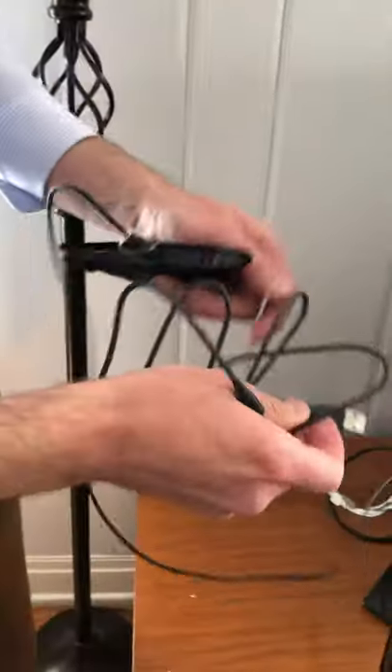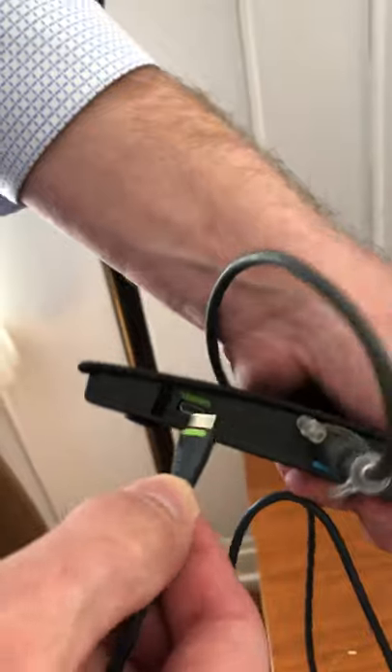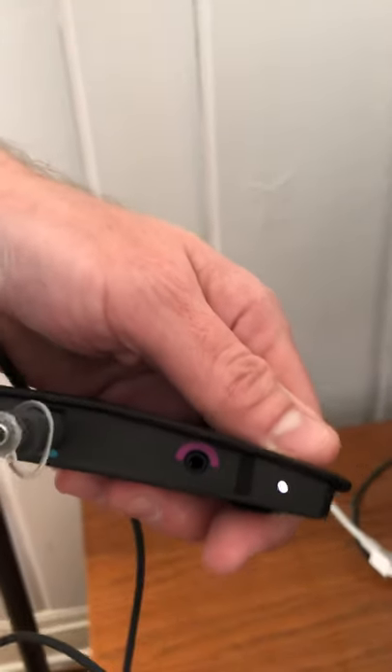The second step is to get the USB cable and plug it into the back of the TV Play, then plug the other end into a USB input on your television. Plug that in securely and you will see an indicator light that tells you the device is receiving power.